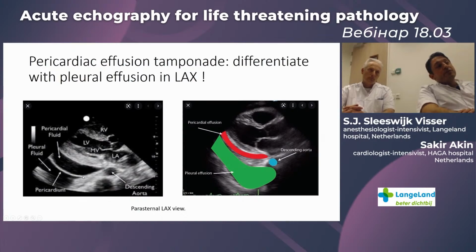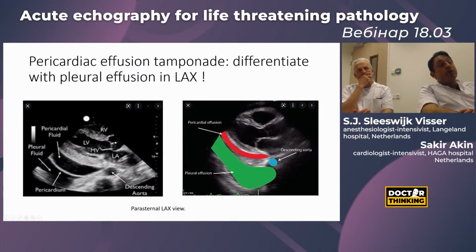And this gives you more idea about what the pathology will be. For example, if the descending aorta size is normal, and the ascending, there may be some other problems, whereas here in this view we don't see any problems in the ascending or the descending aorta as far as we can assess in this parasternal long axis.